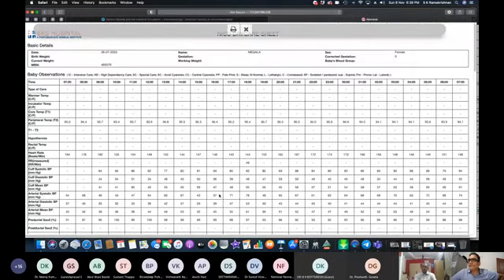So this is how easy it is. Instead of writing everything, everything comes automatically. And this comes as numerical data. But you can also make this appear in the form of a chart or a bar diagram or a dot diagram, whatever it is. As far as you get the data, you can present it in n number of ways. So this is how we capture the data, and the nurses have access.